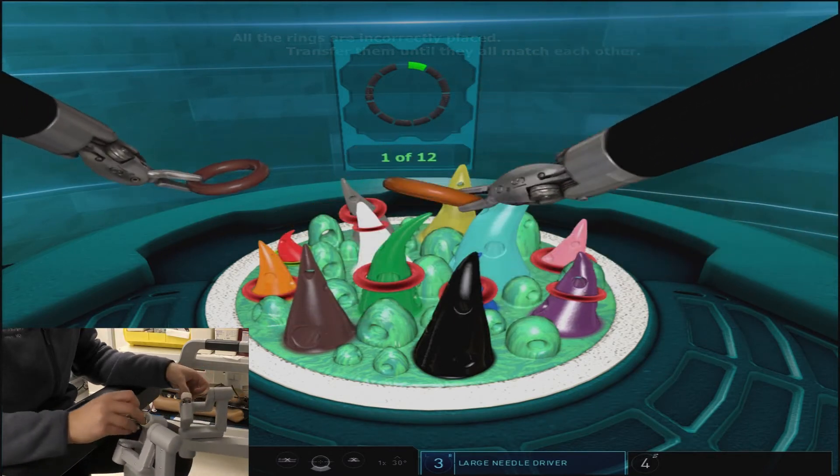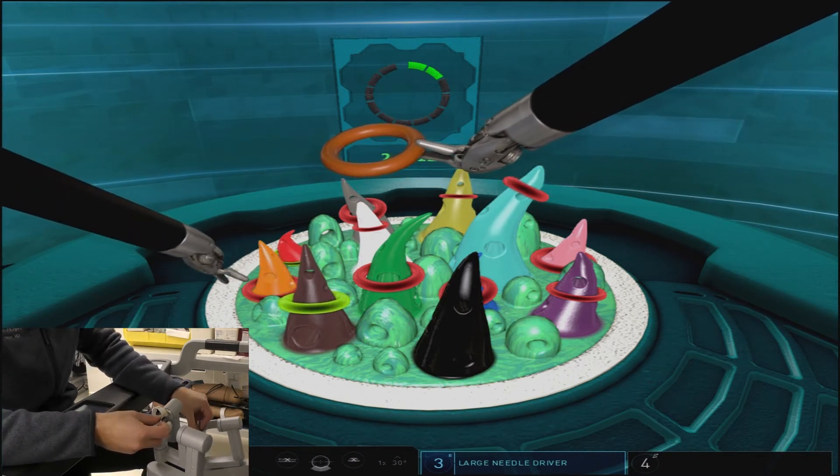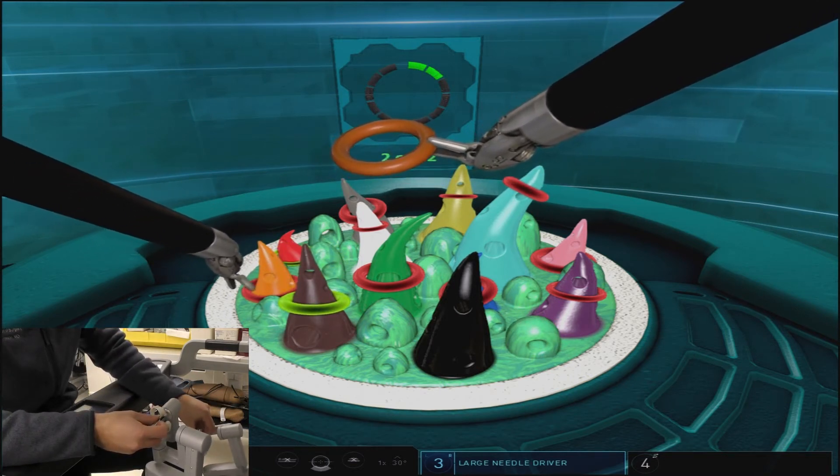This process will continue with alternating left and right arm as to which one is picking up the ring and which one is placing down the correct ring.